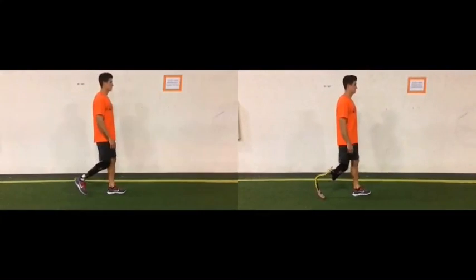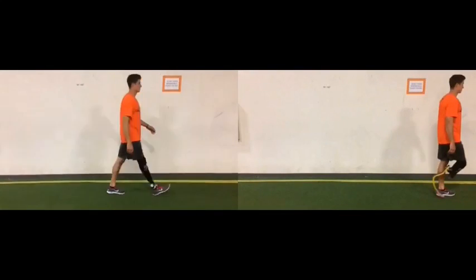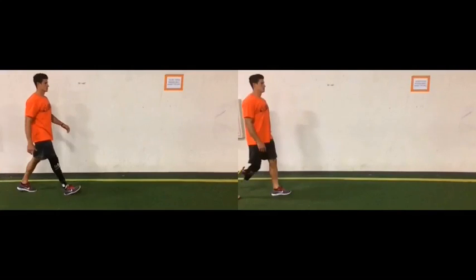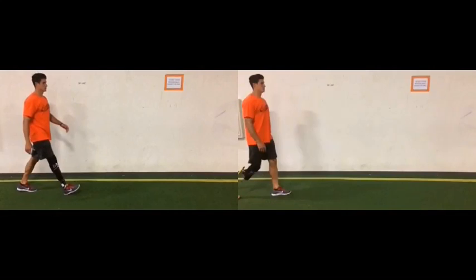So right now we can see that there is a little bit of a difference in stride length and also walking mechanics in general. Let's go ahead and rewind, and I'm going to point out a couple things. On the left screen, we can see that the foot remains dorsiflexed, and there is minimal plantar flexion once the loading phase begins and initial contact. And this is due to the compression of the heel.